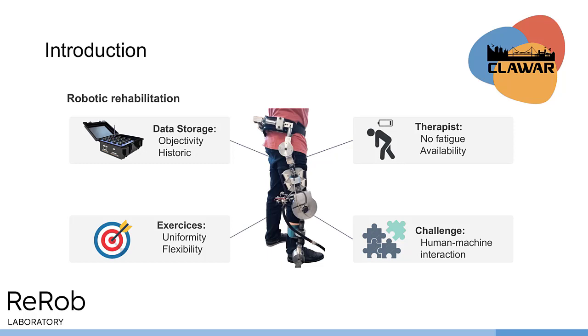Within a rehabilitation session, the therapist often employs movements antagonistic to those of the patient, applying resisting force to promote muscle strengthening. However, over a standard session, the therapist may experience fatigue, requiring rest periods, which can limit the availability for other sessions. Thanks to the incorporation of robotic assistance, rehabilitation helps mitigate the therapist's excessive physical effort, offering the ability to perform consistent and precise movements throughout the session.